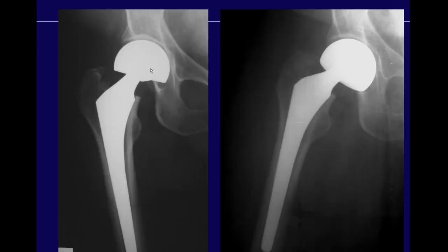Because the cup is not fixed into the acetabulum, you can still get motion of the cup against the native acetabular cartilage. Here in this same patient, you've got an AP and a frog lateral view. Notice the difference in positioning of the cup because it's moving just like the head is moving, and it will also eventually, in a high-demand user, wear away the articular cartilage.